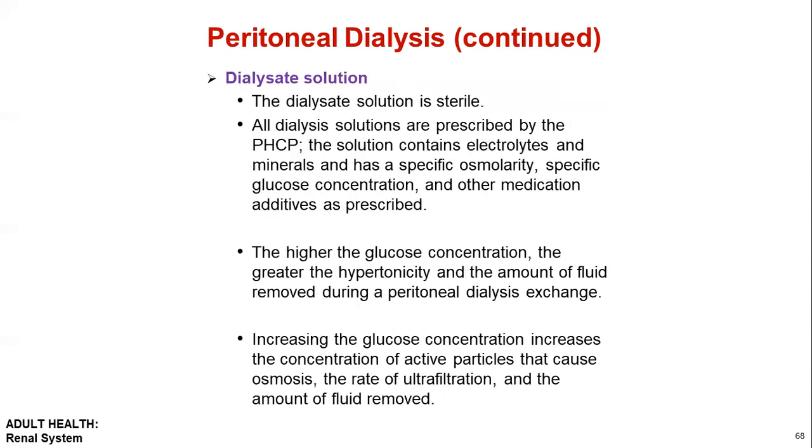So what dialysis solutions do we use? Dialysis solution should be sterile, and all dialysis solutions are prescribed by the healthcare provider. The higher the glucose concentration, the greater the hypertonicity and the amount of fluid removed during peritoneal dialysis.